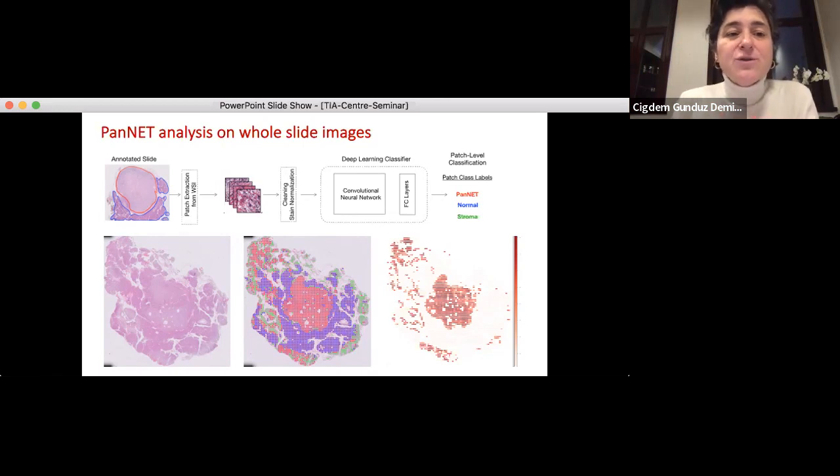That could be a possibility, but these possibilities should be assessed after getting some results, because sometimes you can spend too much time on the annotation, and sometimes it may not be that useful according to what you're doing. Here our aim is to get some quick, preliminary results to understand whether the model is working or not. And of course, if the doctors are interested in getting more details on the boundaries, we need finer annotations. In that case, we may want to go with a dense prediction model where we are making pixel level estimations. Okay, makes sense.